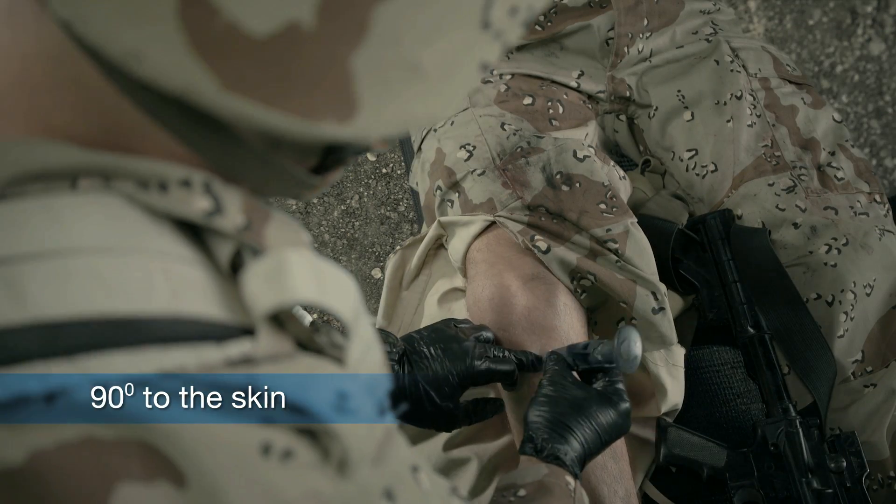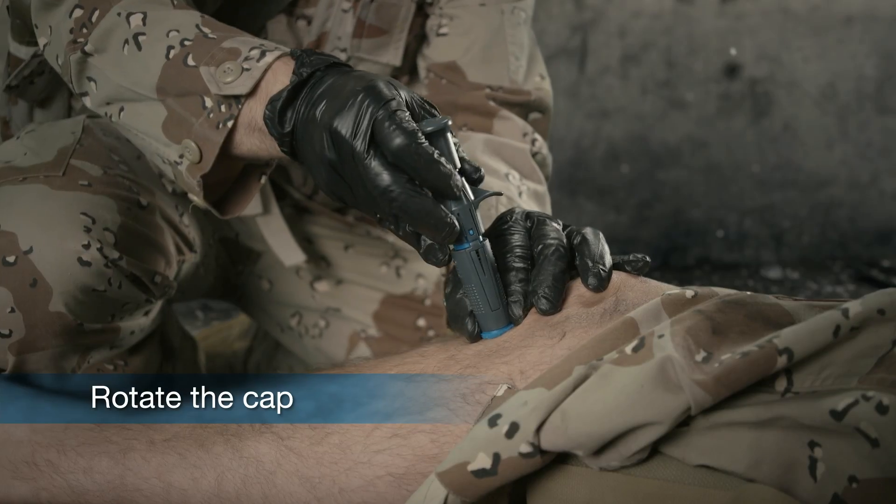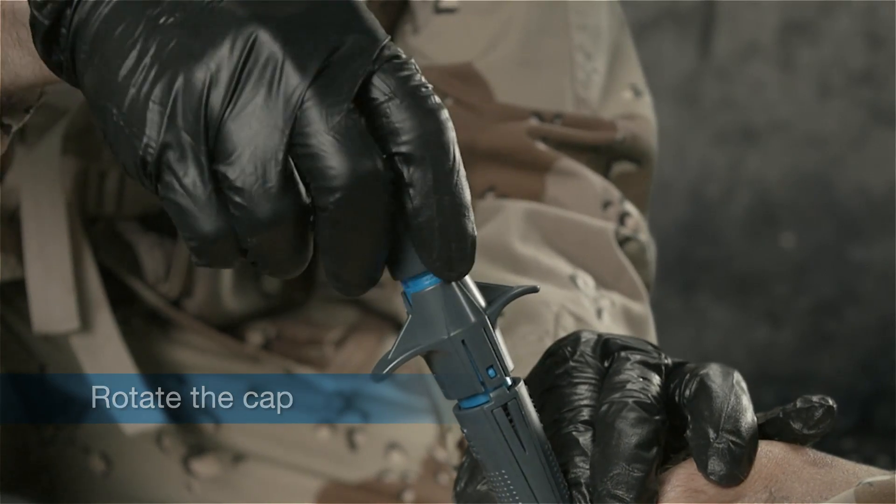Position the Neo at a 90-degree angle to the skin. Rotate the cap. Activate.